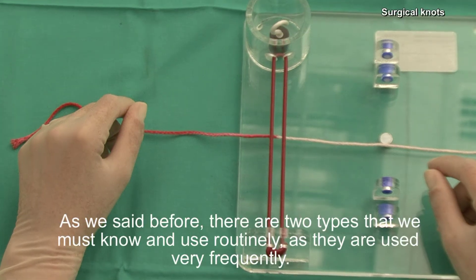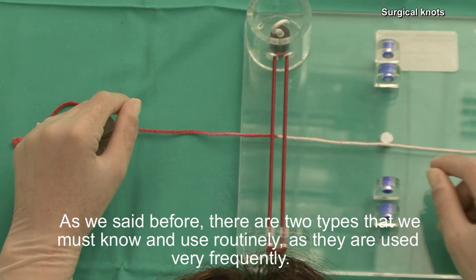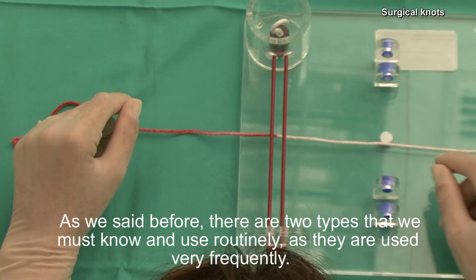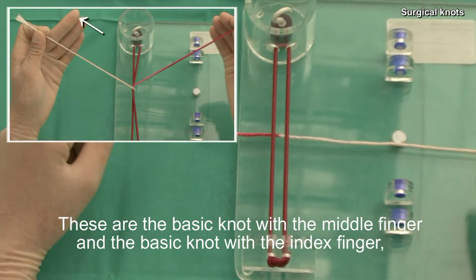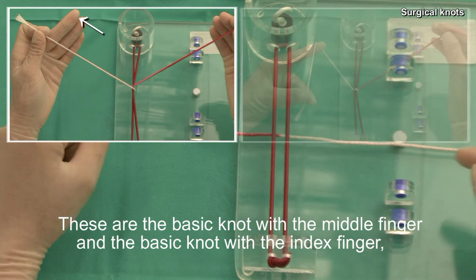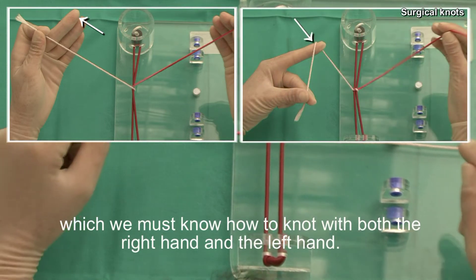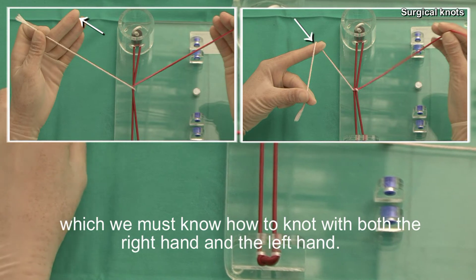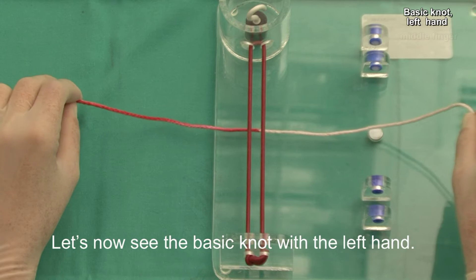As we said before, there are two types that we must know and use routinely, as they are used very frequently. These are the basic knot with the middle finger and the basic knot with the index finger, which we must know how to knot with both the right hand and the left hand. Let's now see the basic knot with the left hand.